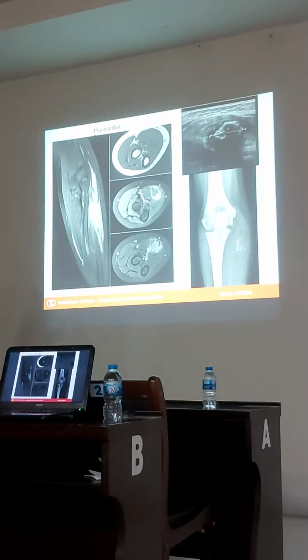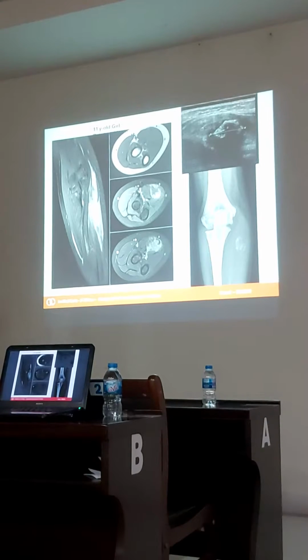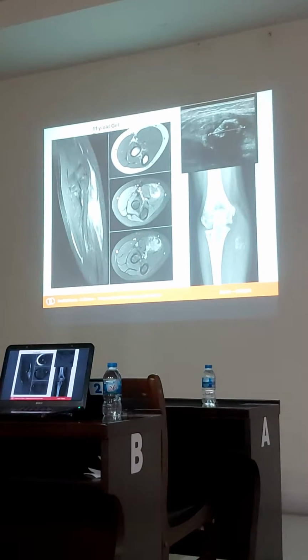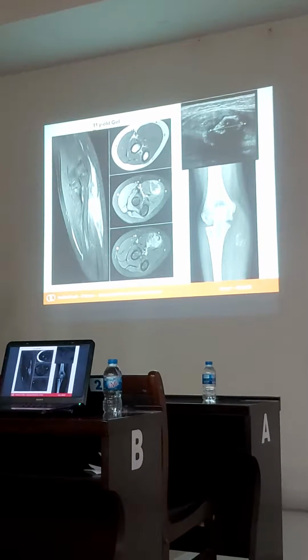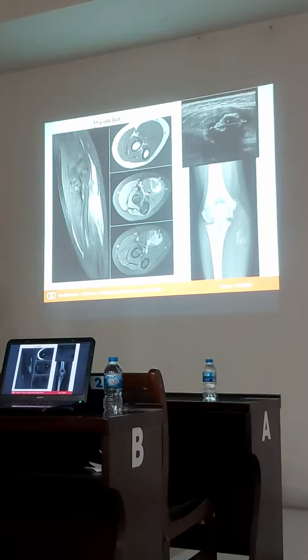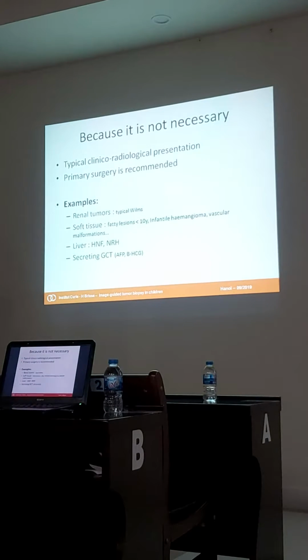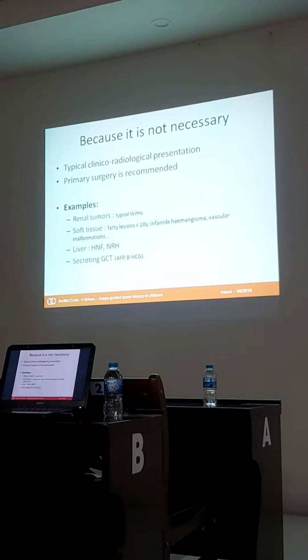If you perform a biopsy here, the pathologist might answer this is a sarcoma, osteosarcoma, because there is bone production in the tissue. Of course, if you discuss with it, you will provide the diagnosis, but it's not necessary and it might lead to erroneous diagnosis. And sometimes you don't perform biopsy just because it's not necessary.